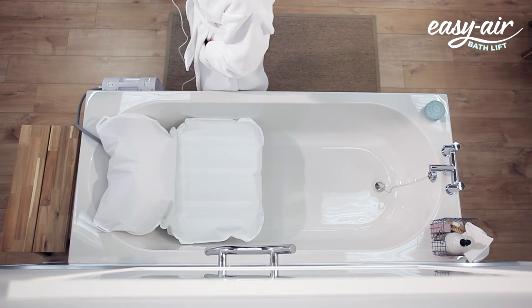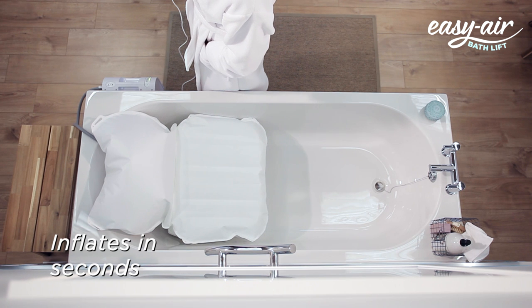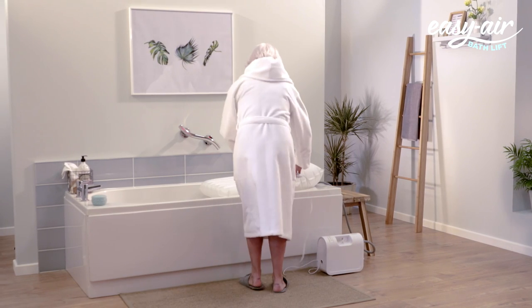The waterproof handset is easy to use and inflates the Easy Air Bath Lift in seconds. The special cushion fabric is soft but very strong and hard-wearing.